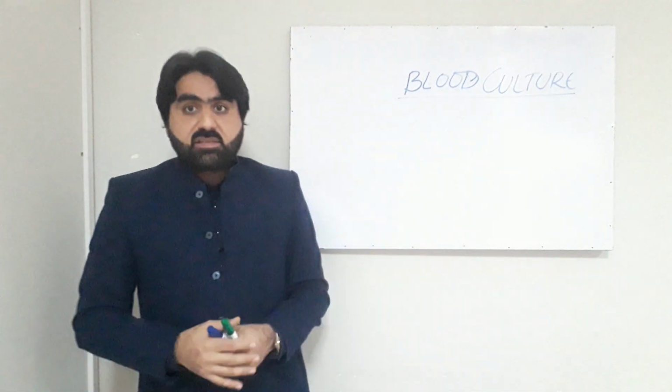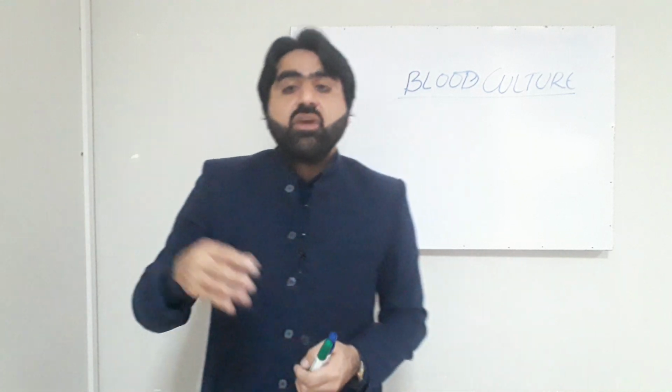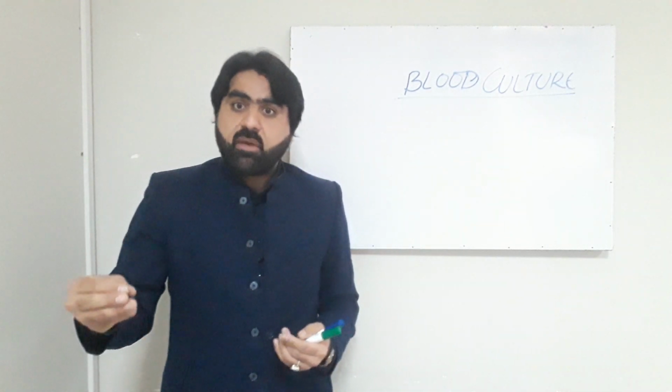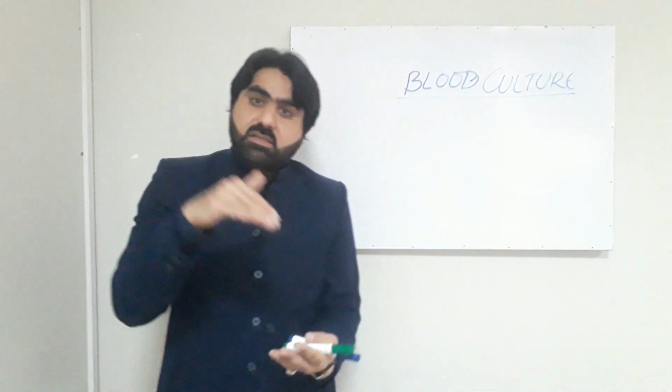Because in other cases, like urine, pus and other specimens, we usually inoculate those specimens on agar, on the surface of the solid media. So why do we inoculate blood in liquid media or in broth?